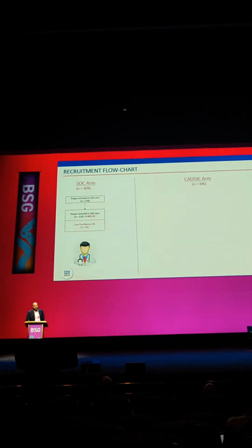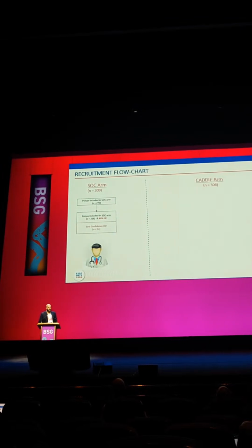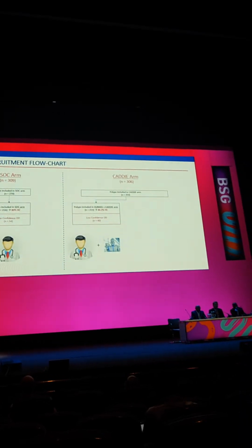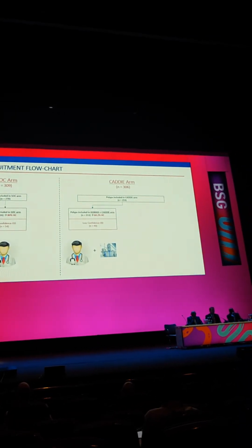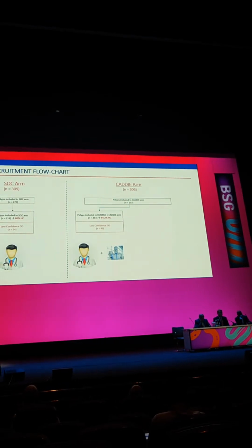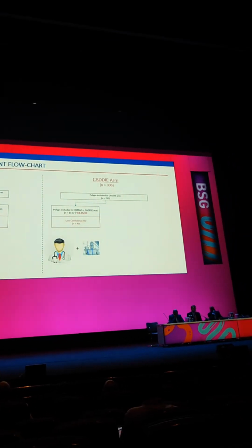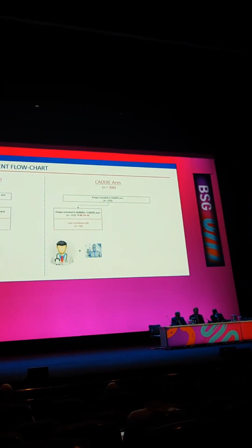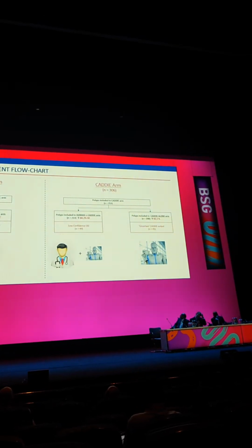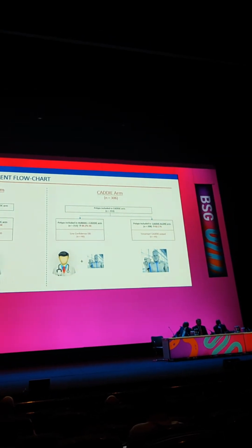So looking at the standard of care arm, we had 270 polyps with a high confidence rate of about 80% in the optical diagnosis. Looking at the CADx arm, so this is human plus AI, you can see that there's 253 polyps with a high confidence rate of 84%, so about a 4% increase from baseline. But there's a third analysis that we did here, which is the actual autonomous performance of the CADx system. So in these 253 polyps, how did the CADx system function when you take humans out of the loop?